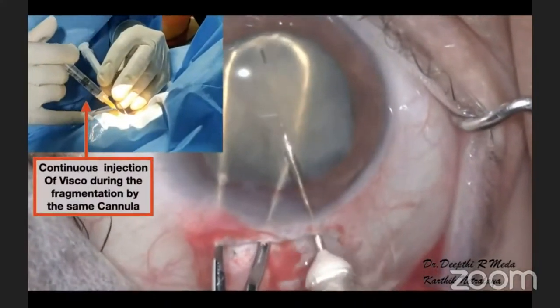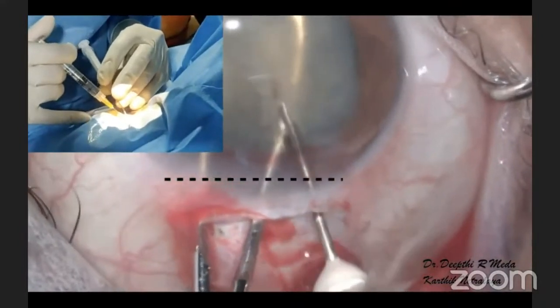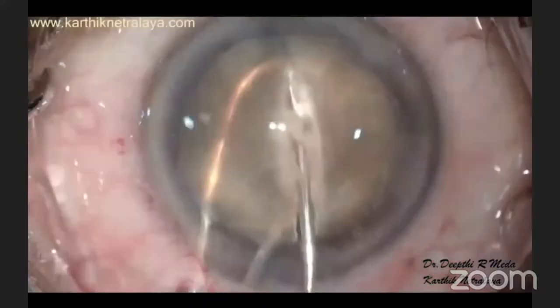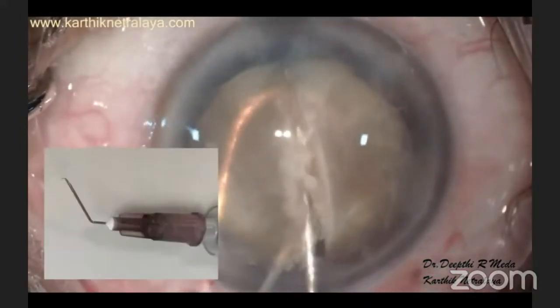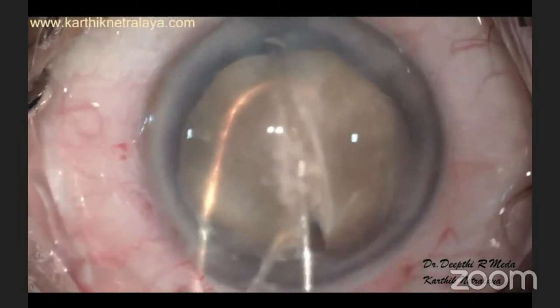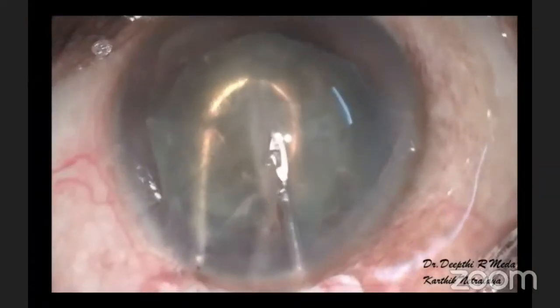In this slow-mo video, the bleed actually allows us to visualize the outflow of viscoelastic that is continuously bathing the anterior chamber. In the next case, as the nucleus was a little harder, a 26 gauge cystitome, the same one used for rhexis, is used here. A few strokes are enough to split the hard core of any nucleus.